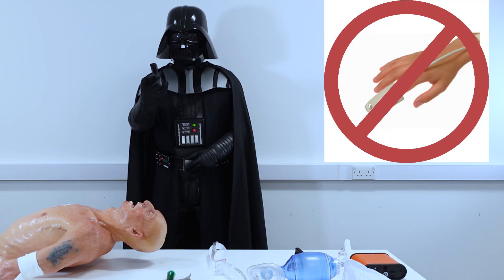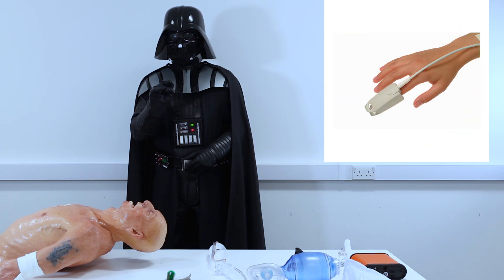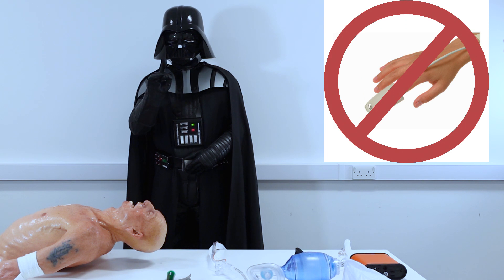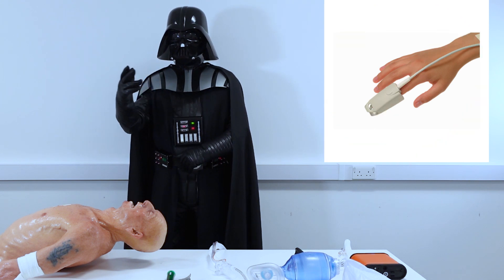I would not rely on SpO2 sensors as values are displayed with approximately 30 to 40 seconds delay and may not be reliable if your patient is in cardiac arrest, shock, or hypothermia.